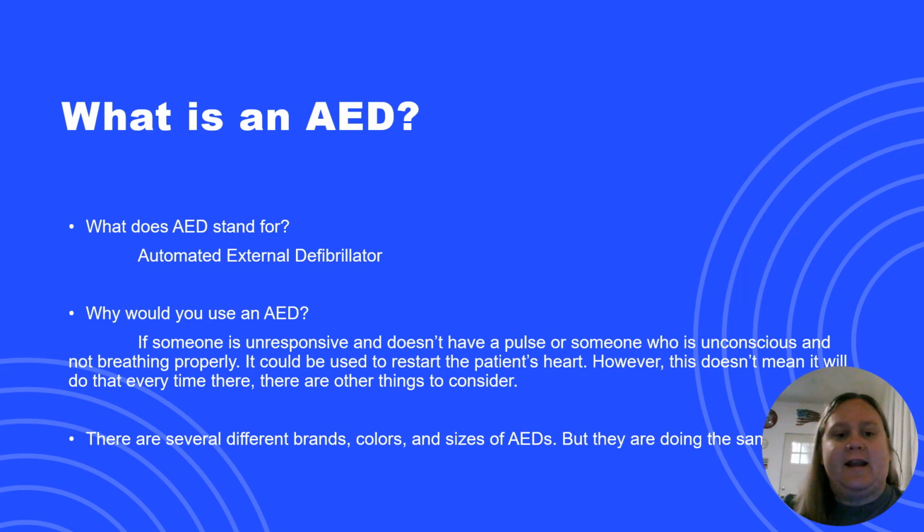All right, so jumping right into it, what is an AED? AED stands for Automated External Defibrillator. Why would you use an AED? In my field, the EMT level, and I'm sure those of you watching probably have more of this too, we get called to a scene where the patient is unresponsive and doesn't have a pulse. We're going to use the AED for that, right?